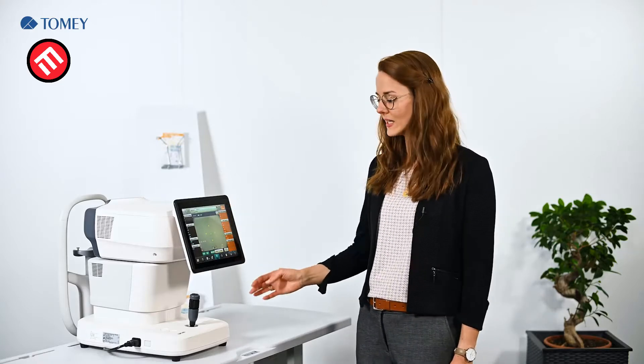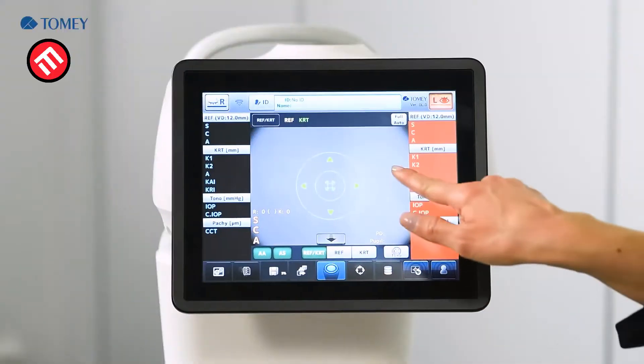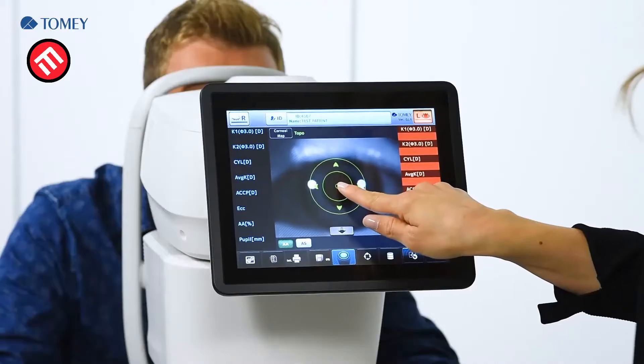And last but not least, this MR6000 includes a dry eye observation function. A big advantage of our MR6000 is that it has auto alignment and an auto shot function. In case you want to adjust the device manually, you can use the joystick and also the touchscreen. Thanks to the auto alignment and auto shot, the operation of the system is very easy and very quick.